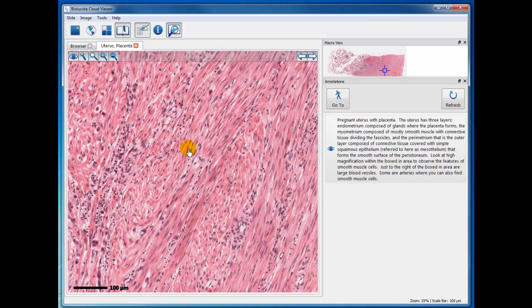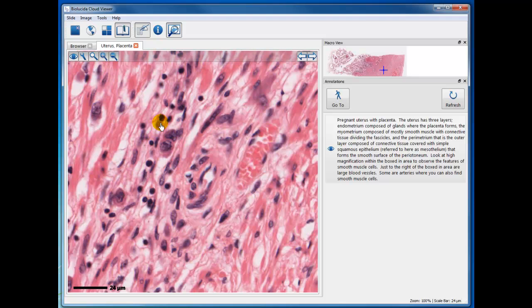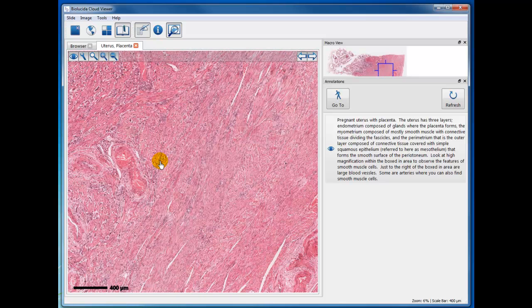Okay, here are some lymphocytes that are in connective tissue between the masses. I'll pause this a minute, to see if I can find, maybe on the urinary bladder we even have better cross sections. Let's see what I can find.